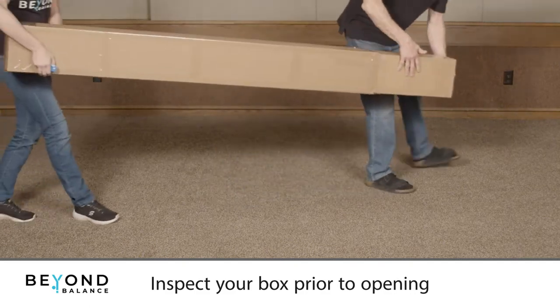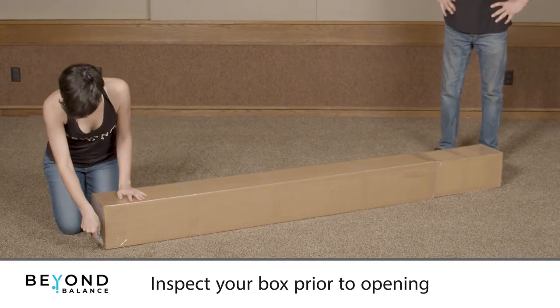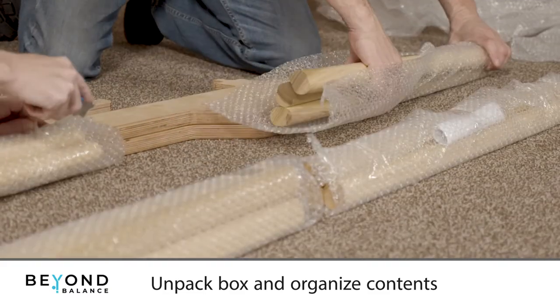Inspect your box prior to opening. If you notice any damage from shipping, take photographs of all sides of the box and the label. Then open and inspect the contents and keep the box. Contact us immediately if there are damaged or missing items.